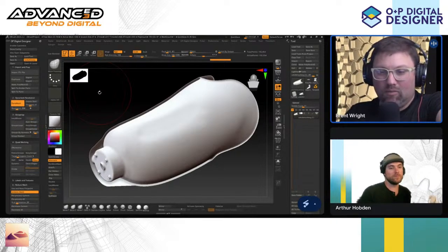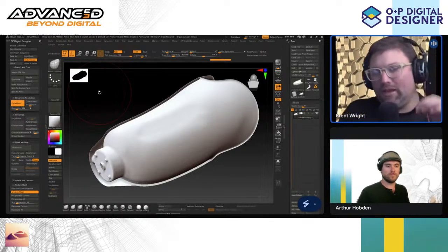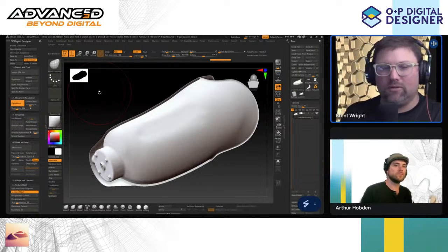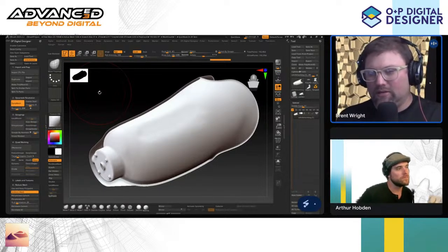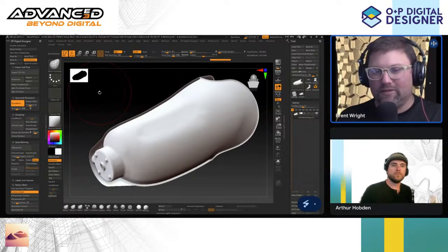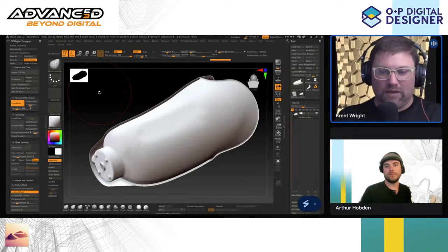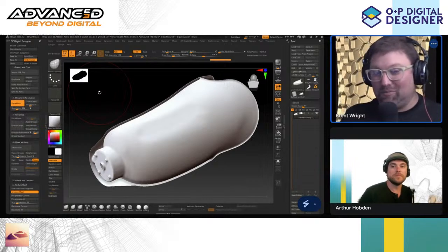I think one of the things that is super important with any of these programs is you want to put the clinical decisions into the clinician's hands. And I would say most of the clinicians couldn't care less how the socket was made and designed, and they don't actually want to know. They want to put in the modifications, and then they want the socket to pop out, right?